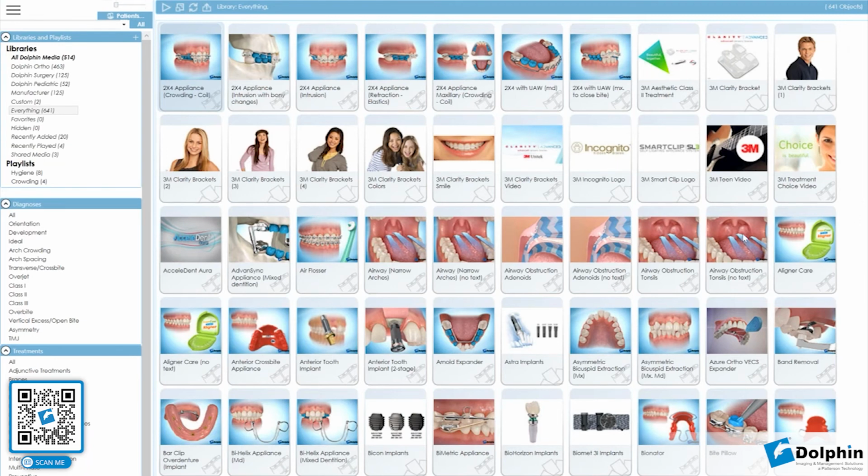Joe, we have a question from Kalina Vanderborn. I may have missed some, but can you merge videos together into one single video? For example, ideal smile photos. Merging, so it's like a single movie. That you can probably do with third-party software if that is your question.